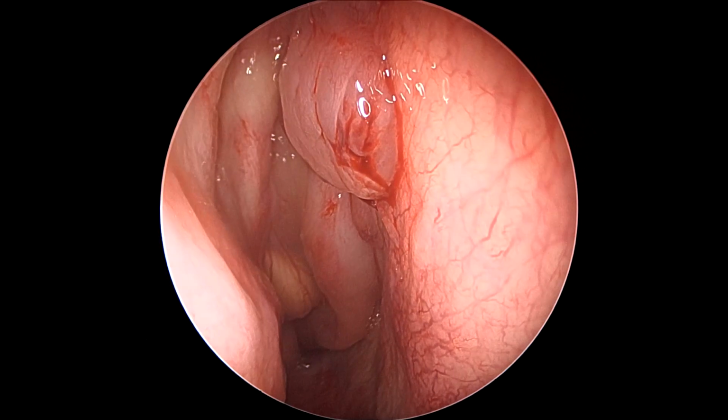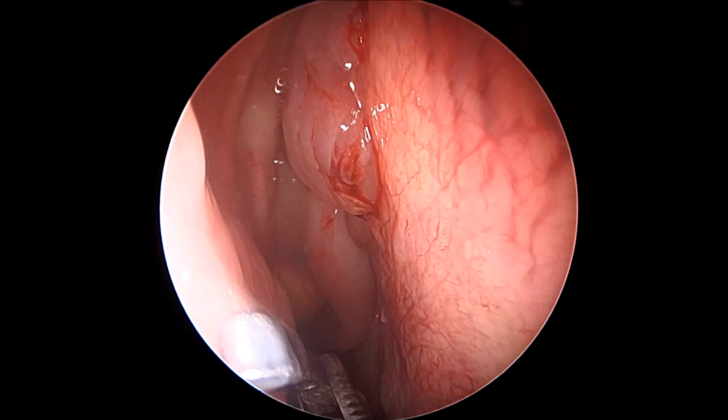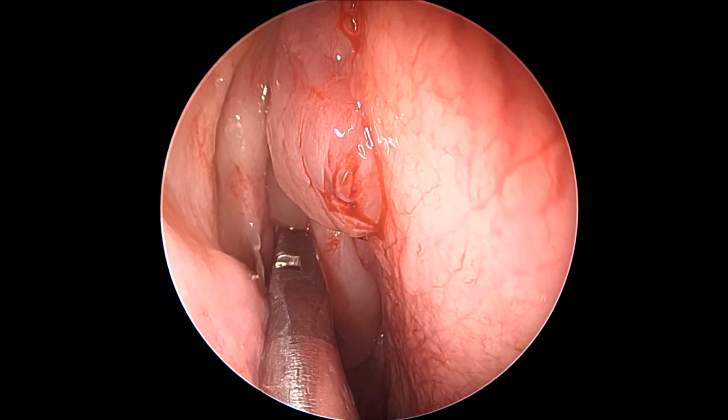We see here how the same looks on a parasagittal section, and these sections are very important in overall orienting ourselves towards making a perspective of three-dimensional anatomy of the paranasal sinuses with regards to endoscopic sinus surgery. This picture shows us the polypoidal lesions on both sides of the nasal cavity.